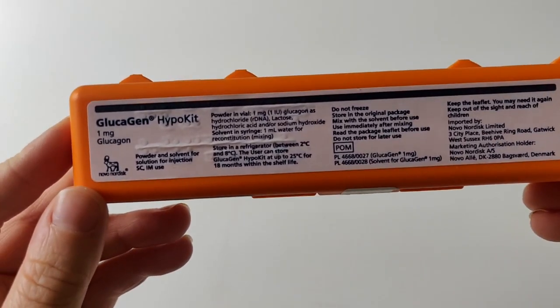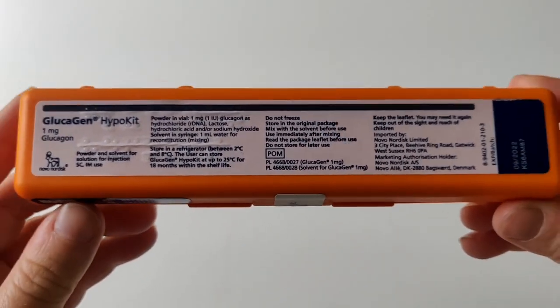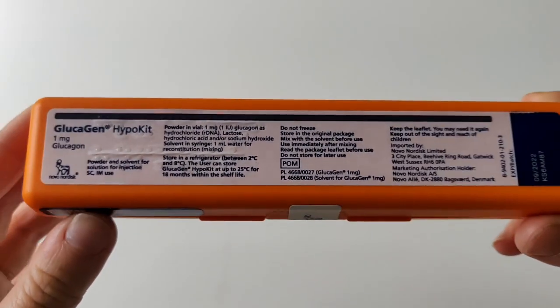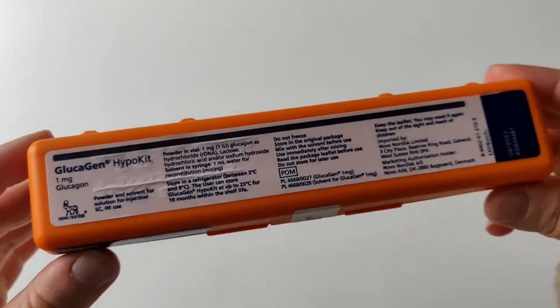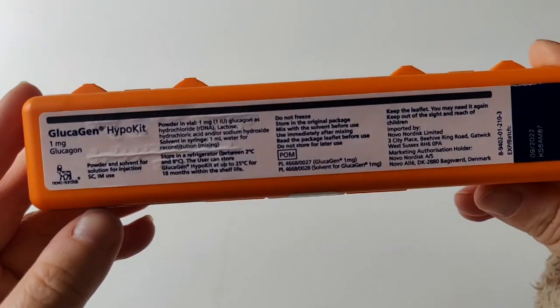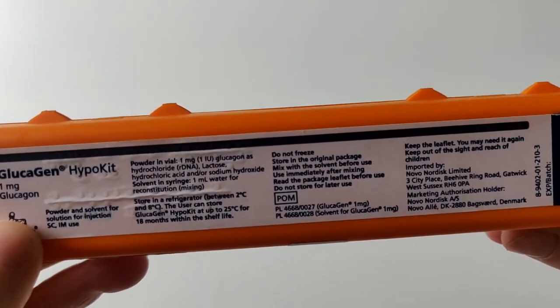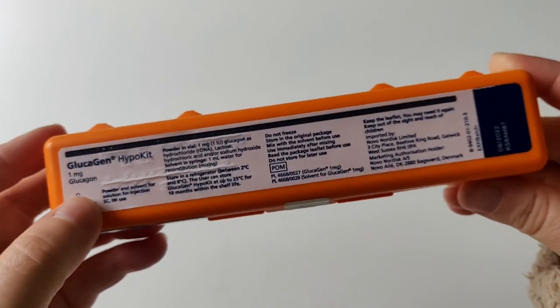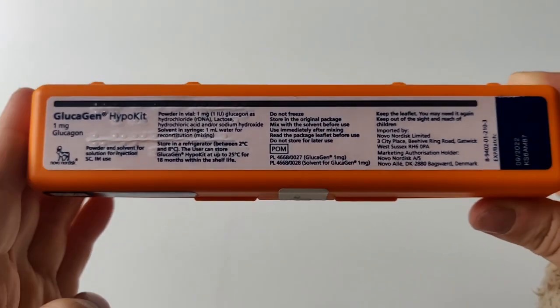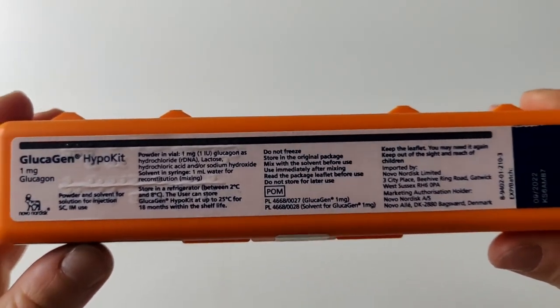If you've never come across a glucagon hypokit before, or you're newly diagnosed, this is used if there's an extreme low blood sugar and you are unconscious. Obviously you can't use this on yourself, so a paramedic or someone that you trust will use this on you. Essentially the glucagon hypokit is an injection of glucagon, which is an extremely fast-acting form of glucose, so that if you are unconscious someone can inject you and you can recover from your extreme hypo and come back to consciousness.